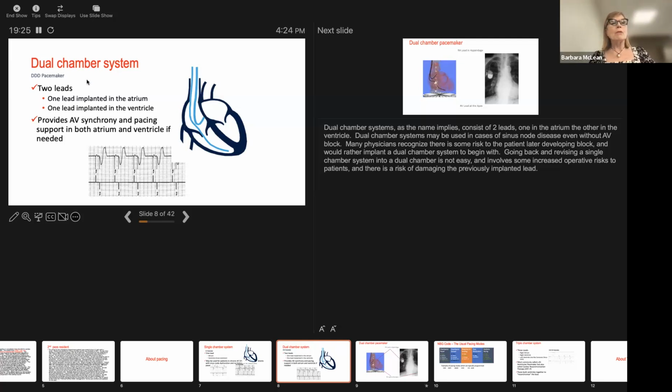Okay, so dual chamber, I have a spike to the atria and a spike to the ventricle. Now here we're very lucky. We see spike followed by P wave. That's really extraordinary. And then a spike followed by the QRS. So this is spike atria, spike ventricle, spike atria, spike ventricle, spike atria, spike ventricle. You're firing at an equal rate. The spike-to-spike interval of the atria equals the spike-to-spike interval of the ventricle, and the response is in a timely manner. This is a beautiful strip.